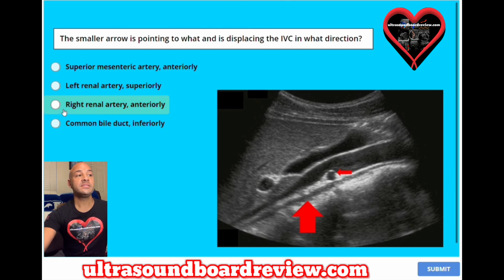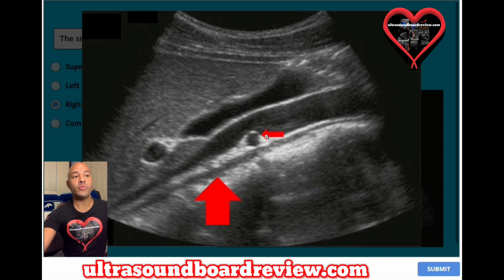The answer is C, right renal artery and anteriorly. So right here is the right renal artery. This is the IVC, and the IVC is being displaced anteriorly.